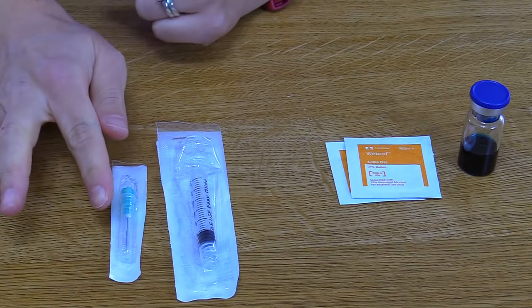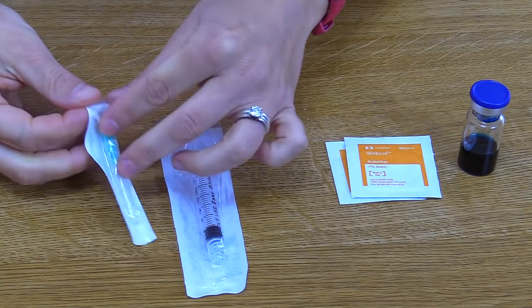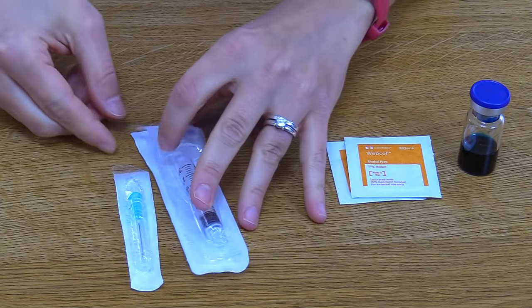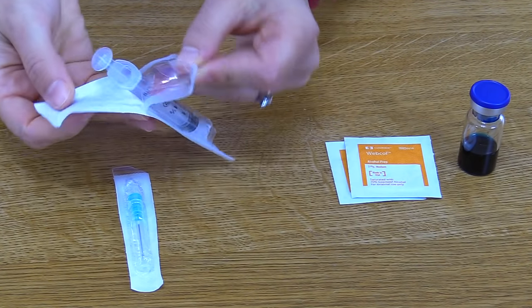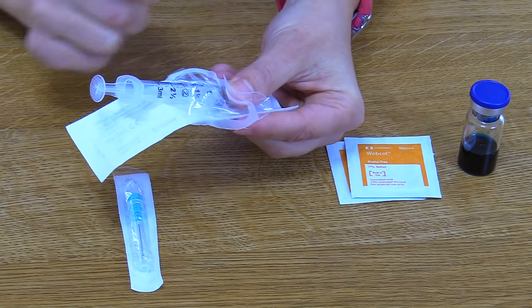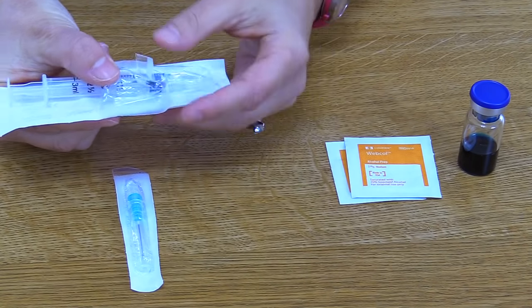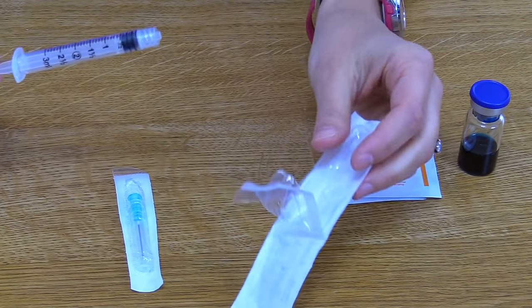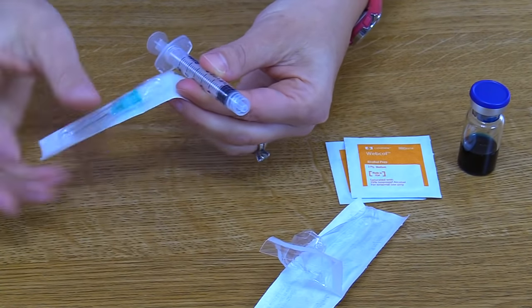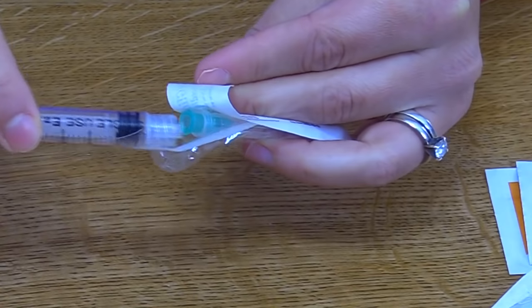We're going to attach a regular needle to the syringe's needle adapter. First, open up the packaging of the needle and leave it in there, then open up the packaging of the syringe. One important thing to remember: you only want to touch the plunger phalange and the barrel — never touch the shaft of the plunger or the tip, as you can contaminate your syringe. Hold it at the barrel, then open the needle packaging and put the adapter into the end of the needle.